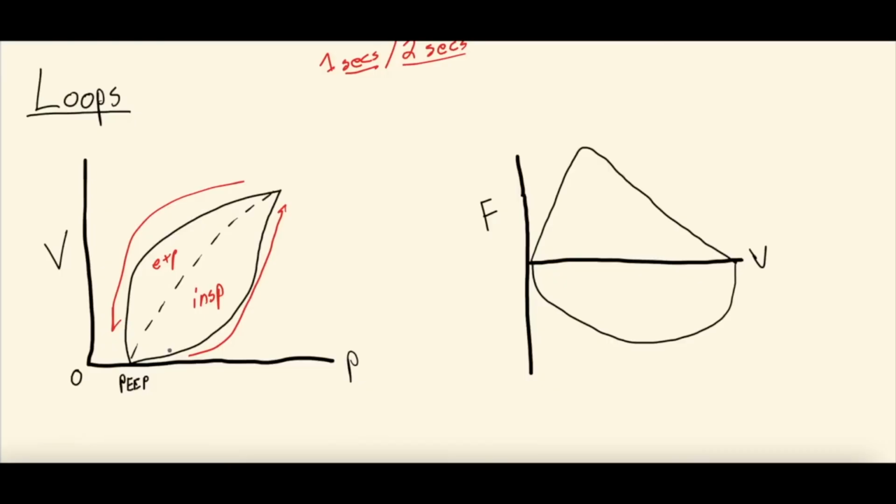So if we were to draw this and make it a touch more obvious, the inflection point is something like this. Very flat, and then an abrupt change where it starts to go up. And this would be the lower inflection point, LIP. What we can see happening here is the pressure is increasing with very little volume increase up until this point, right? And the thought with the lower inflection point is that this is where compliance changes.